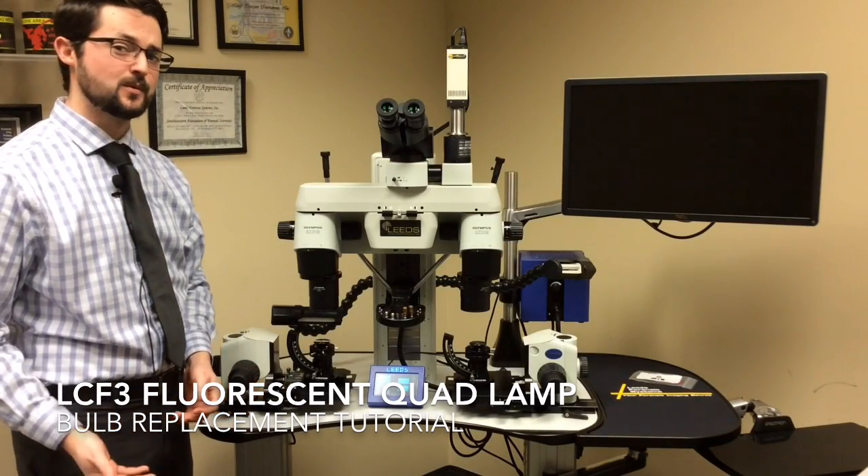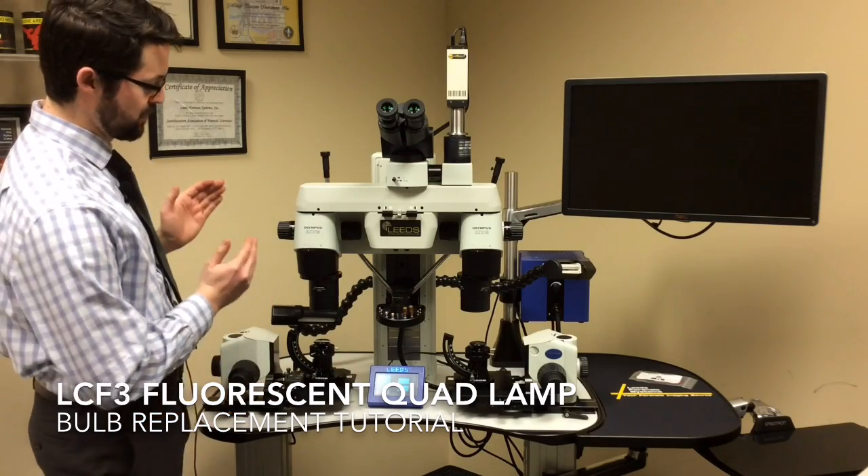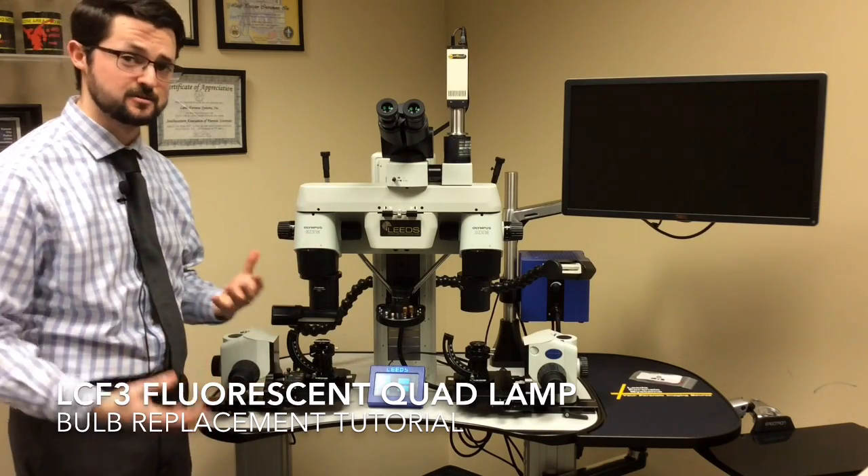Hi, my name is Jake Kurth. I work with Leeds Forensic Systems. Today we're going to be going over how to replace the quad lamp bulb on the LCF3 comparison microscope.